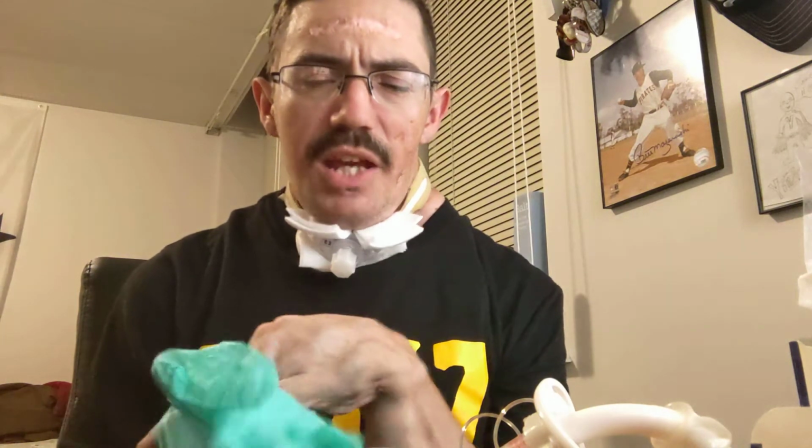Now, I've already opened up the case. This is what it was sitting in, and inside it has the suction tube, the suction catheter, I guess you would call it, and the glove. It comes with gloves, because obviously you're handling a tube with your hands, so you want to make sure you have some sort of sterile thing to do that. And so I'm going to put on this one. I can't really put on the glove with this hand. And so, yeah, that's what you do.